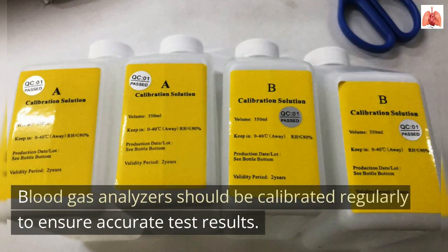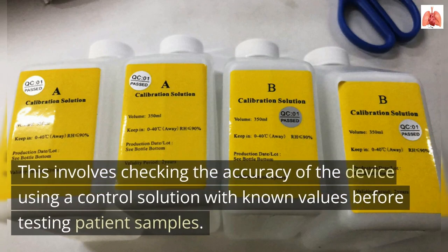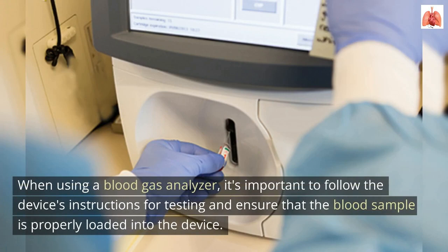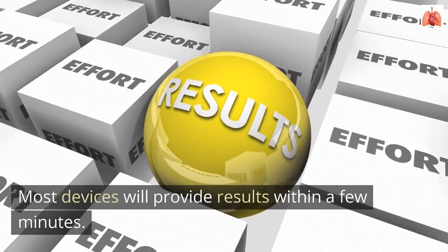Blood gas analyzers should be calibrated regularly to ensure accurate test results. This involves checking the accuracy of the device using a control solution with known values before testing patient samples. When using a blood gas analyzer, it's important to follow the device's instructions for testing and ensure that the blood sample is properly loaded into the device. Most devices will provide results within a few minutes.